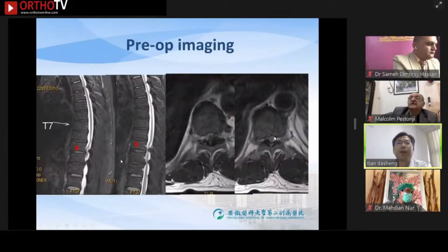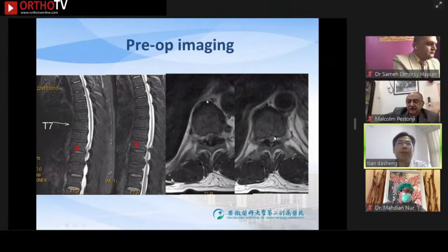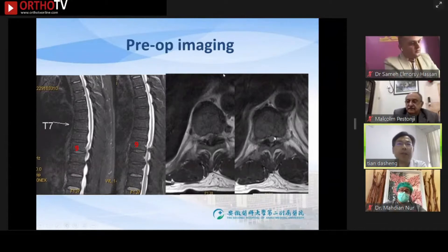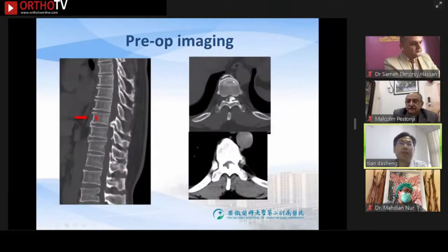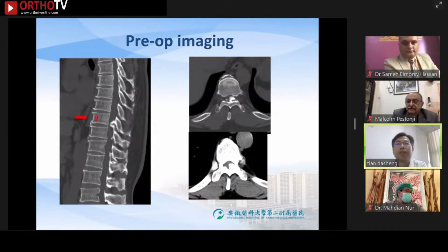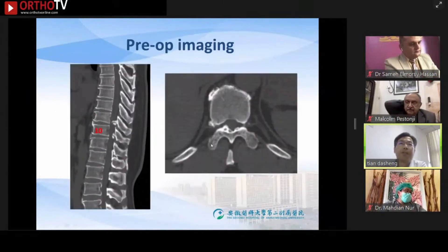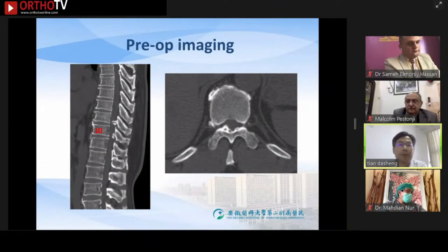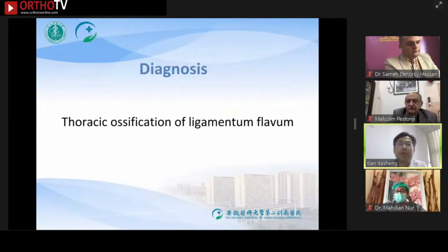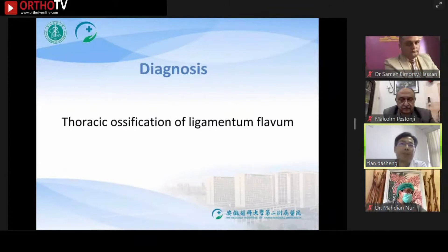Let's review the pre-operative radiological data. MRI shows compression at the segment of T9 to T10. The CT scan shows that the compression at T9 was severe, with ossification mainly from the left side. The ossification at T10 is smaller, mainly from the right side. The diagnosis is thoracic ossification of ligamentum flavum.